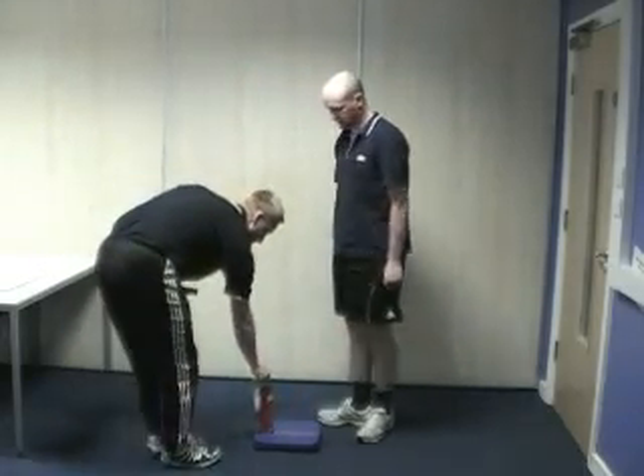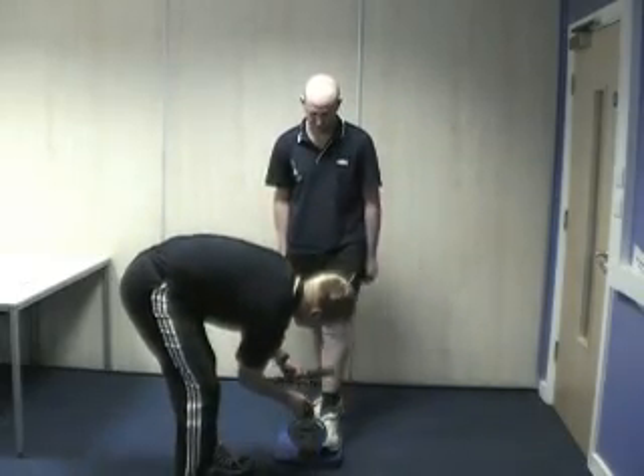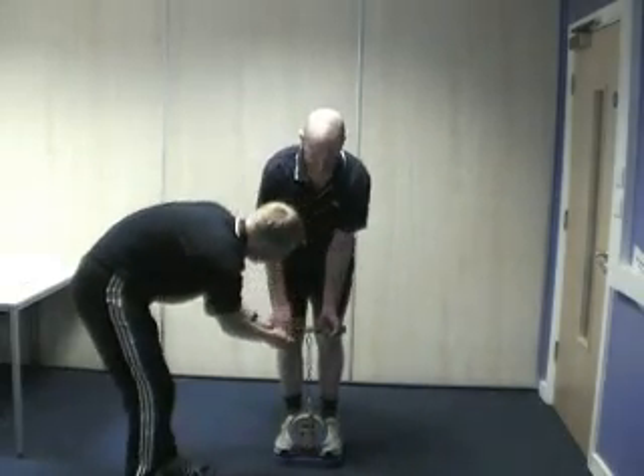The test should be carried out three times to create an average. The following is the test from the front.